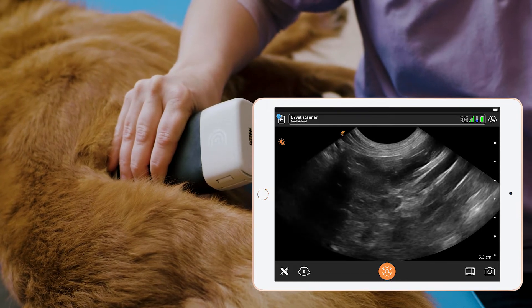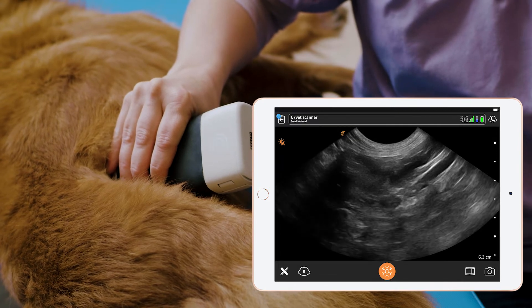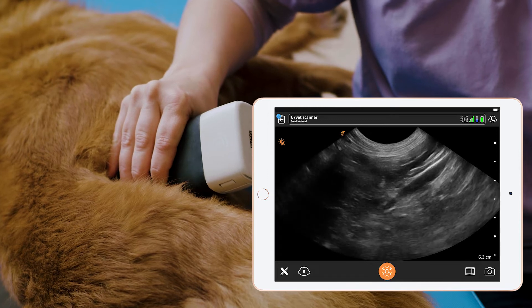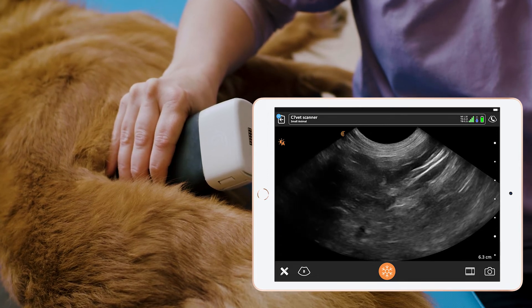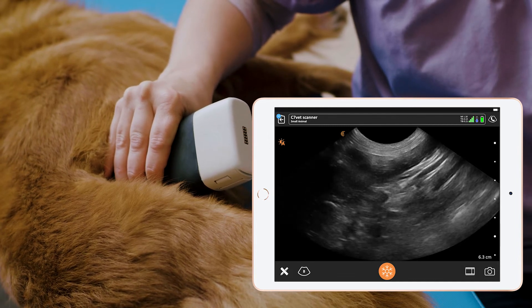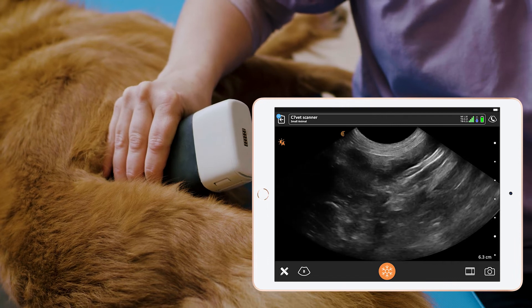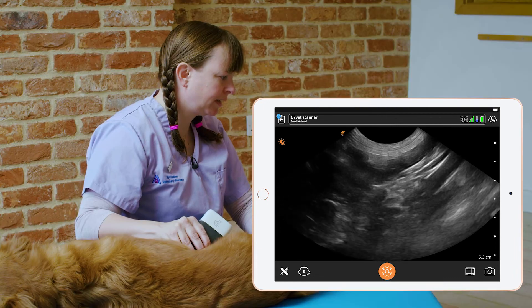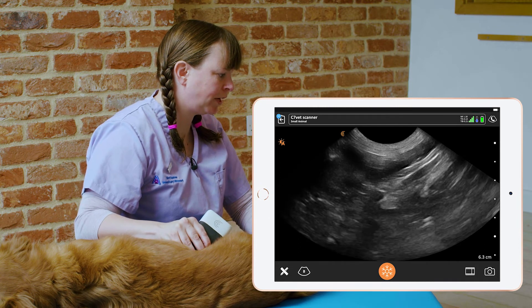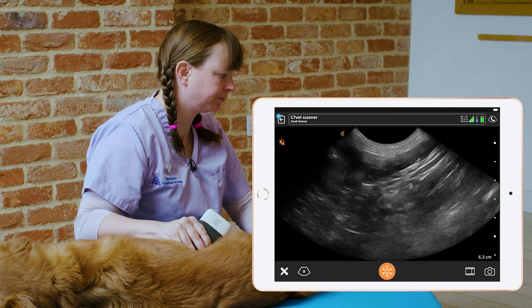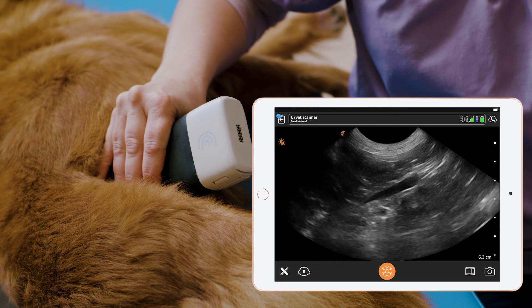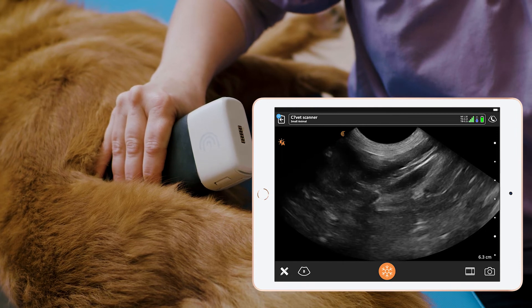So we just fan slowly in this area and we're looking for a more arrow-shaped or torpedo-shaped structure, and there we can see the right adrenal. We can apply a bit more pressure so that it gets closer to the probe — it's a lot straighter than the left adrenal, which is more peanut-shaped. It's about the level of the cranial mesenteric artery, which we can see just below there.